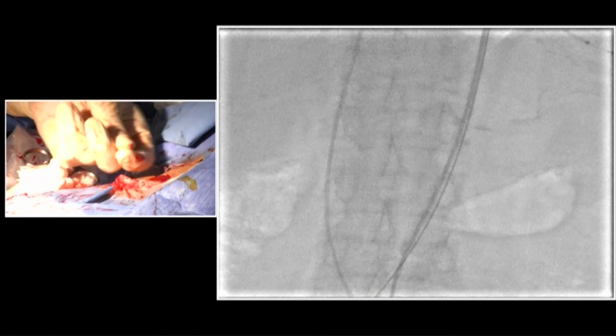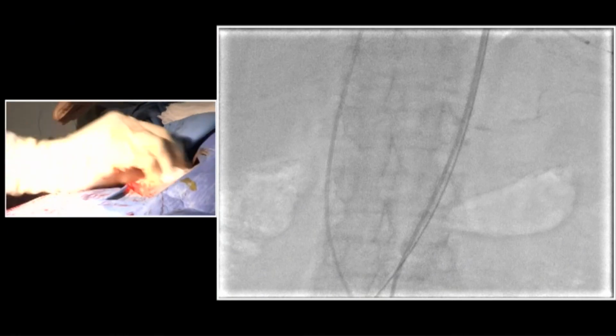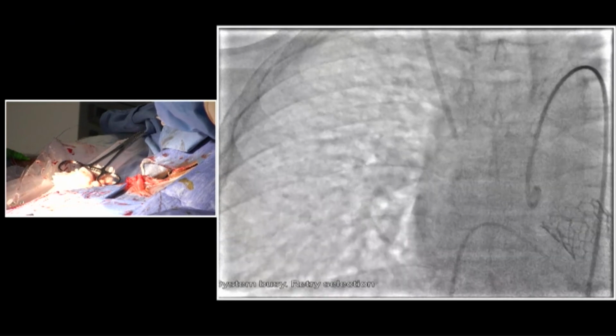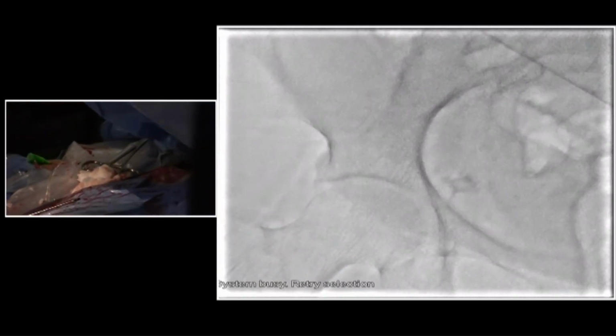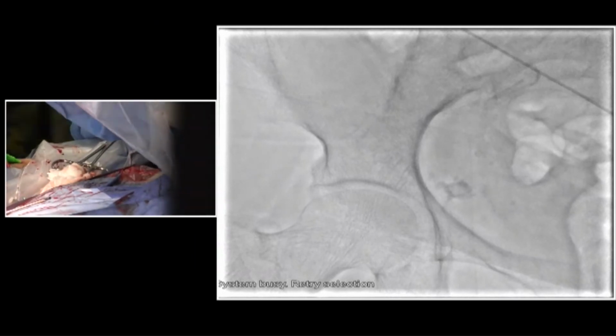Okay, and show us the DSA, please. Right groin. That's become a default approach as well. Can fluoro be removed and the groin be bigger? I think now it's stopped totally. Thank you. I think you can see it. Can you show the DSA once before we move away from the filter? Very good. I think with one device itself, you have stopped it.